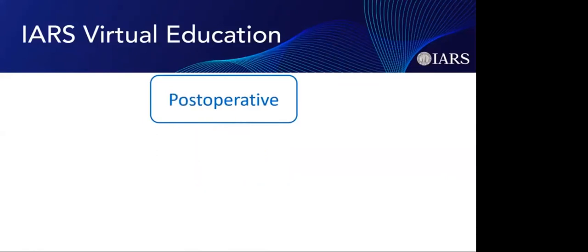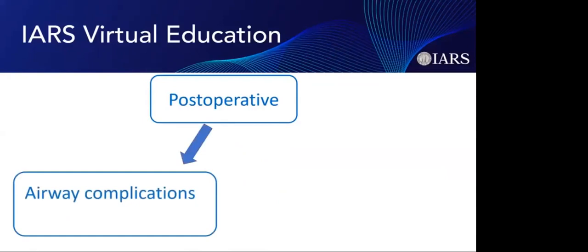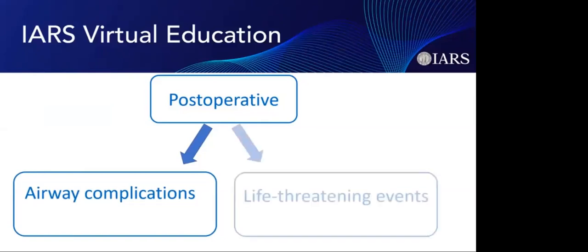Lastly, post-operatively, POCUS can be used to determine and assess airway complications, and more particularly to this scenario, it can be used to determine vocal cord injury or vocal cord palsy, and likewise to determine and assess life-threatening events such as a pneumothorax.